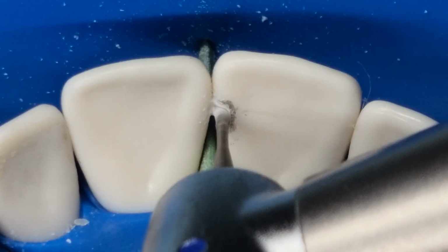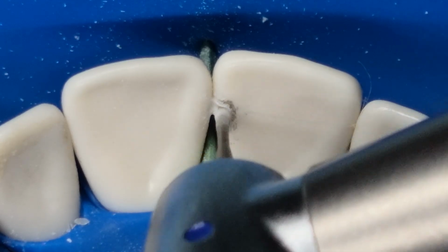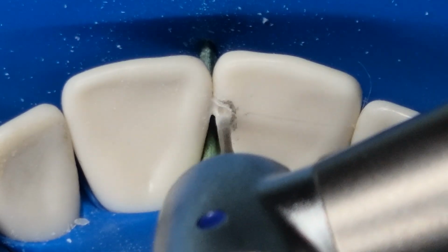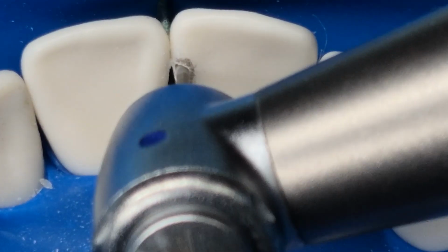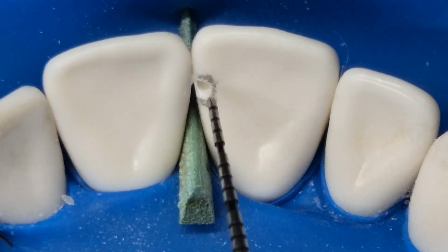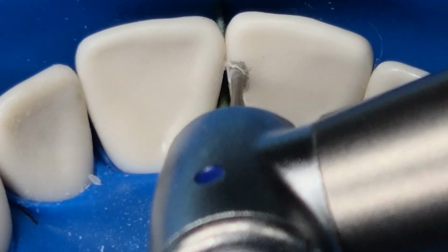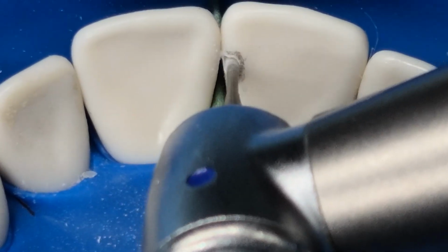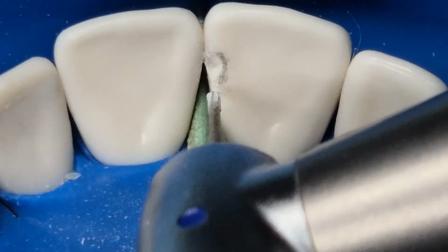At the center of the marking you have drawn, establish the initial depth. Don't advance the burr to full depth yet. Rather, go 1 to 1.2 millimeters to give yourself room to adjust at the end when finishing the cavity, and that's to obtain an accurate depth. You can now extend the cavity outline incisally and gingivally.